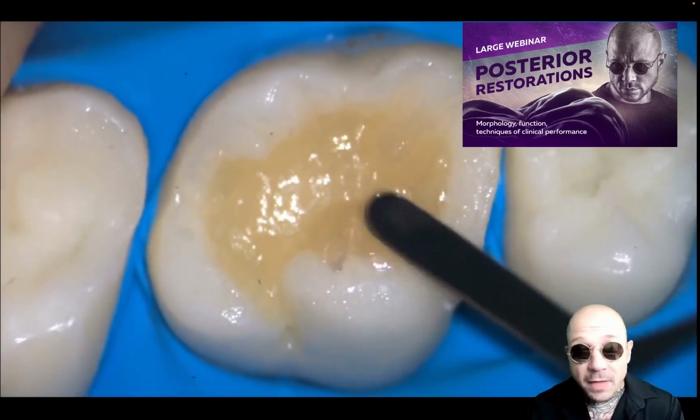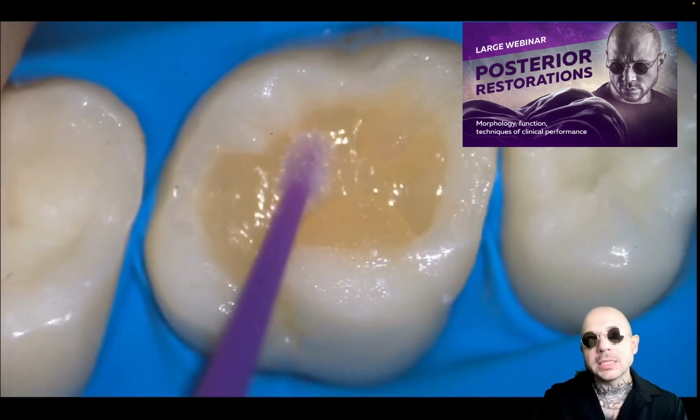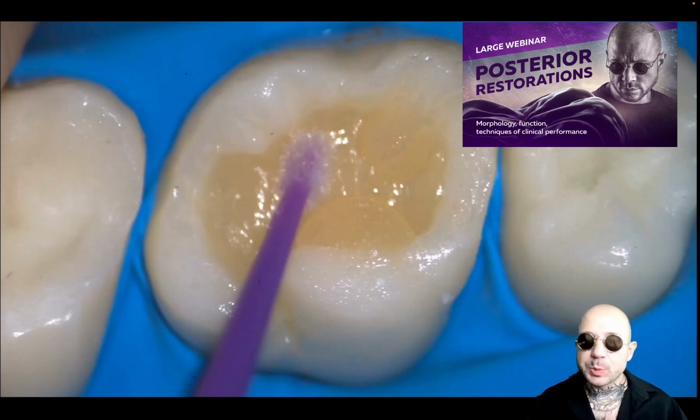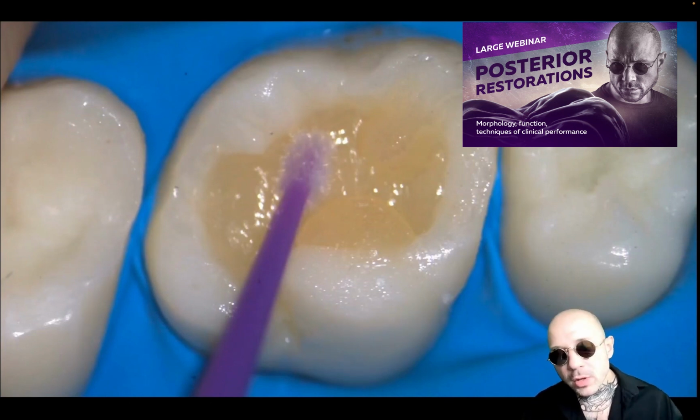And the essence of the method is that we need to place the portion at first, adapt it to the surface. Then we need to take a mirror and get the view from the side perspective, from the distal side or from the medial side. Of course, we can do it only with using the mirror.